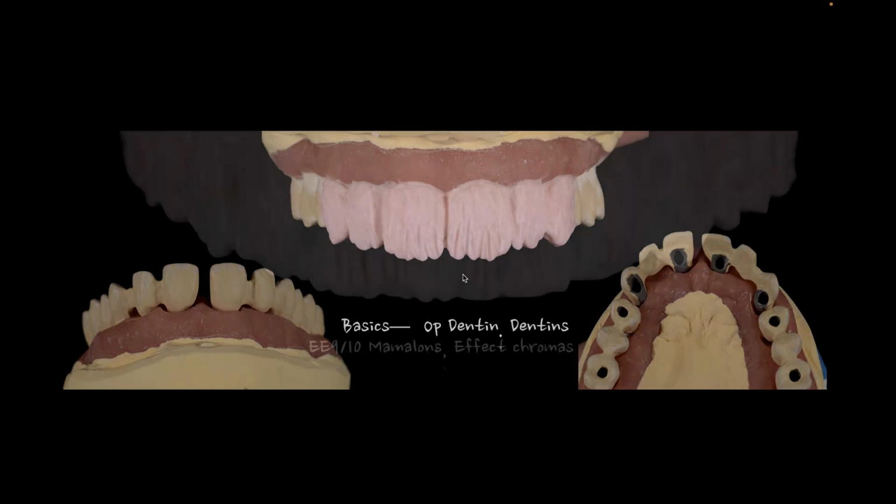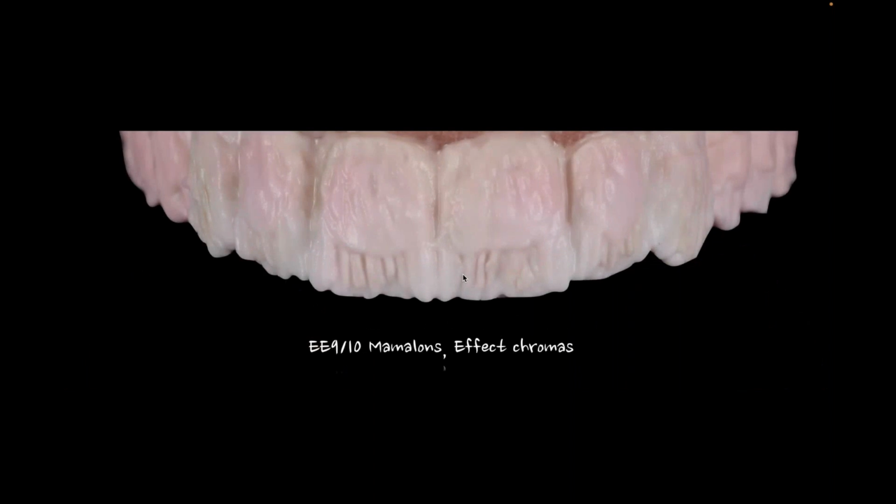So I'll start in by using my translucent materials. In this case, this was VM13, so a little EE9 and EE10 mixed. I'm going to start using my mamelons here across that material, and I might come back sometimes with either an effect chroma that I might want to use for a mamelon or a chroma plus, or even an opal material on the interproximal areas. That's really dependent on how much translucent I want. In this case, I just stuck straight to the EE9 and the EE10 and some mamelons in between.